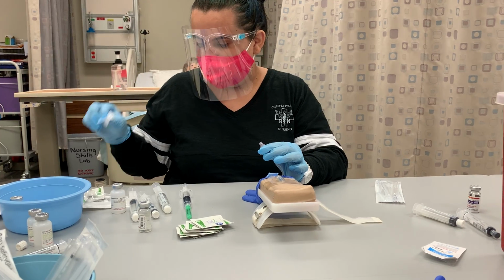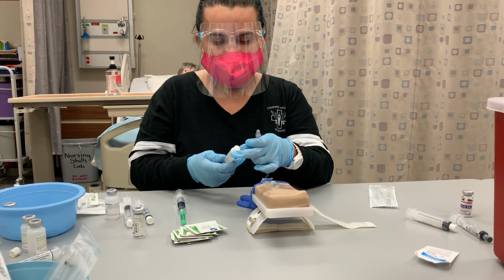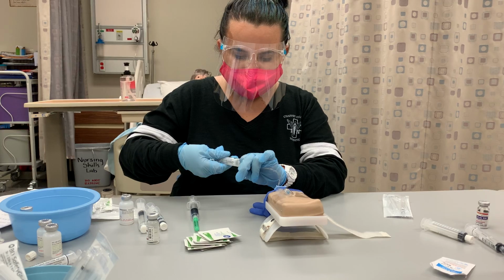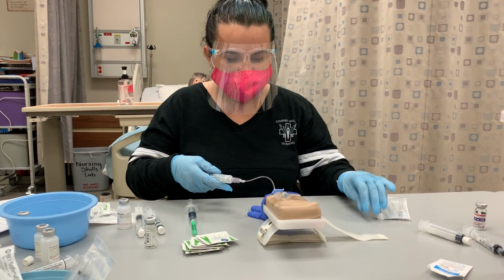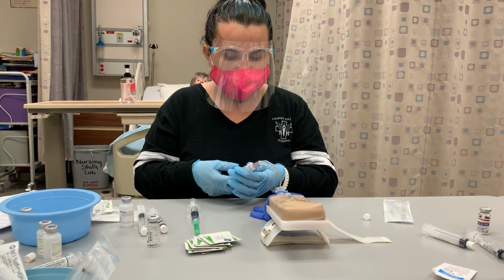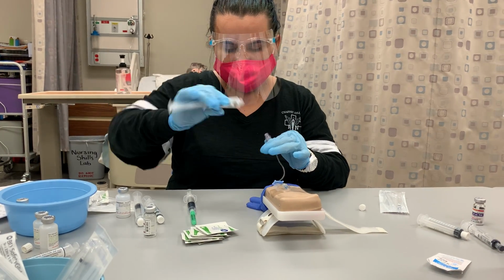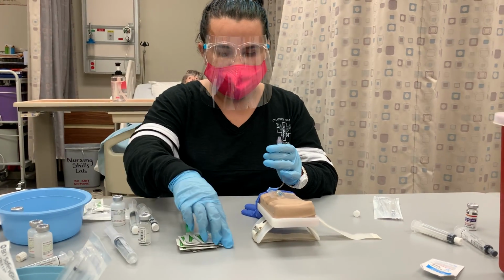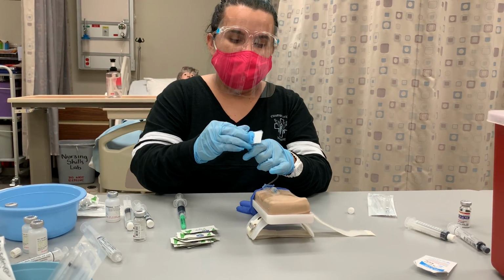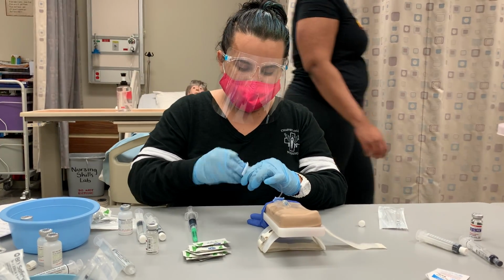Okay, 15 seconds have gone up. And from here, I would grab one of my flushes, uncap, attach. And what I want to do here is look for flash. Okay, I see flash. That's what I'm looking for. After that, I want to unattach my flush and discard of it appropriately. Get another alcohol swab. Scrub the hub for 15 seconds. Apply friction to the top of the hub.